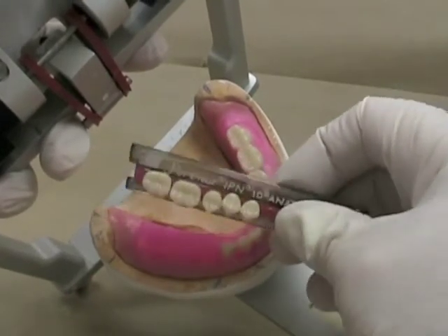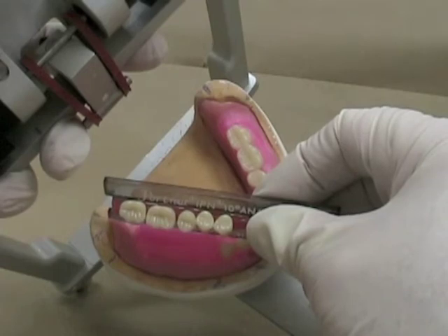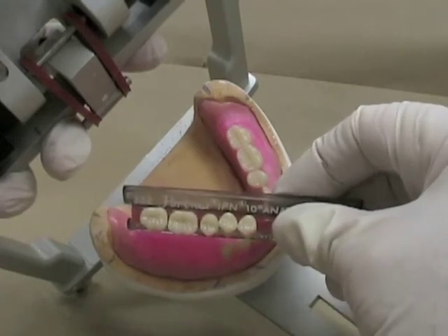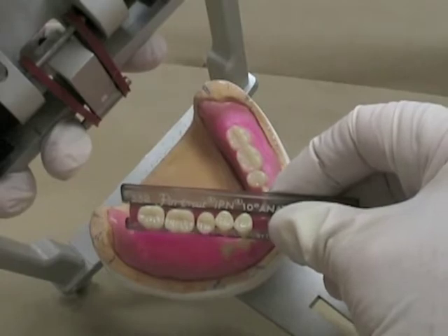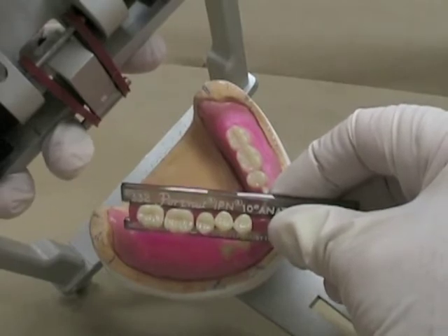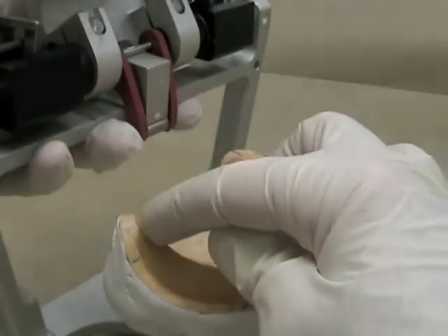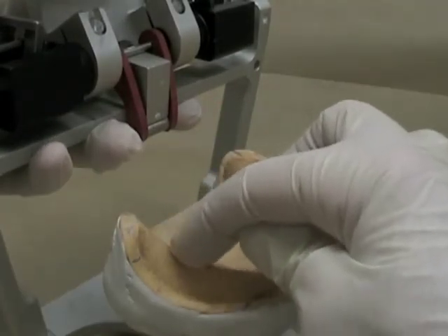We're going to set the mandibular teeth first so that the central fossa is along that line. You can see that if we set all of these teeth, it's going to go right to the very back end of the denture, so in this particular case we're going to set one premolar and two molars. That will give us a sufficient occlusal table and won't cause us to start setting teeth on the ascending portion of the ridge.